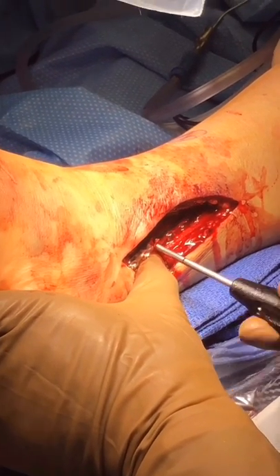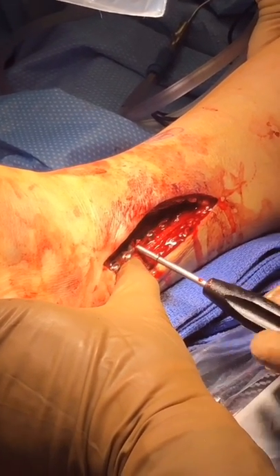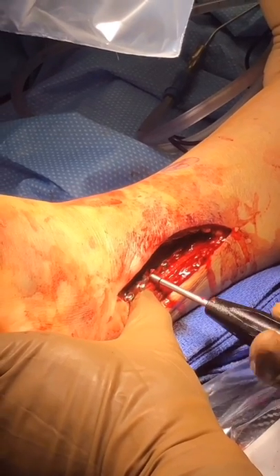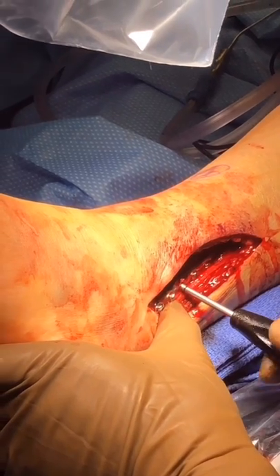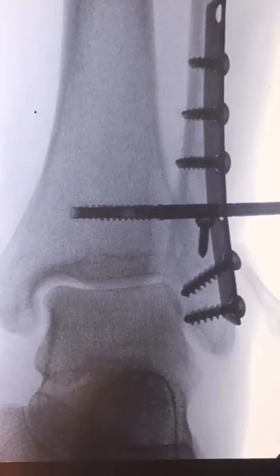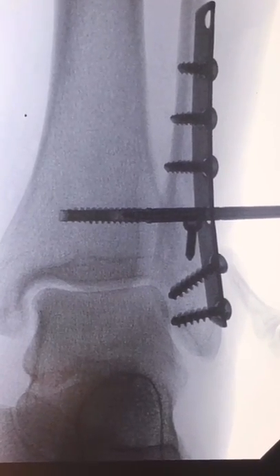However, it is recommended that this is confirmed under fluoroscopy that it is fully engaged in the tibia. Here you can see a fluoroscopic image of the tibial screw being advanced into its final position and confirmed to be fully seated in the tibia.